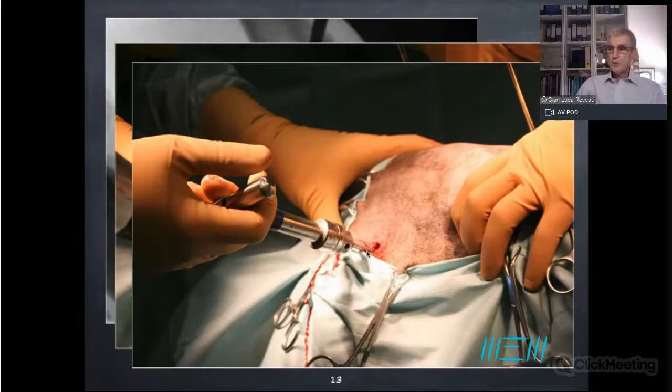Don't think to pull in a very aggressive way. In most cases, it's just enough to lay on the Jacobs chuck, meaning that someone will stay there. It's a good time for jokes, to spend some time while we are waiting for the progressive reduction due to the traction that we are exerting.